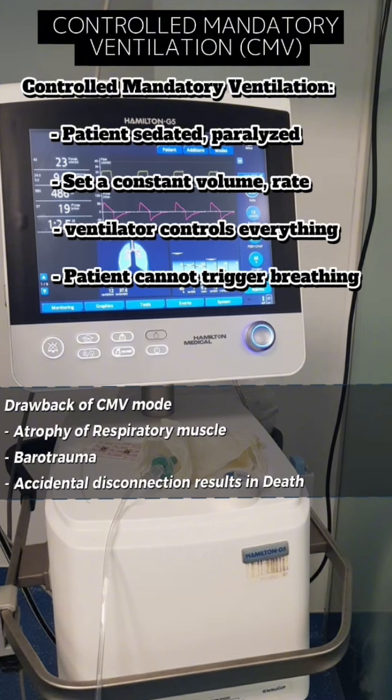And the most dangerous drawback is accidental disconnection leading to death. Sometimes the ET tube is disconnected from the ventilator tubing and ventilator control of breathing is lost. The patient is sedated and paralyzed. The patient may die due to the accidental disconnection.